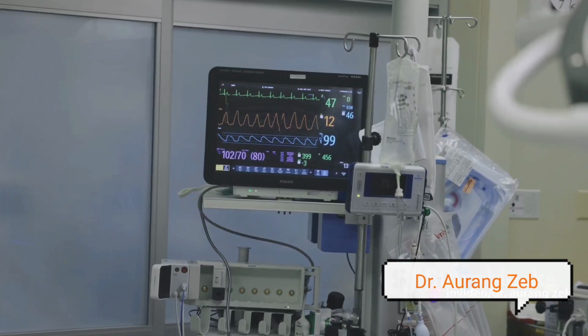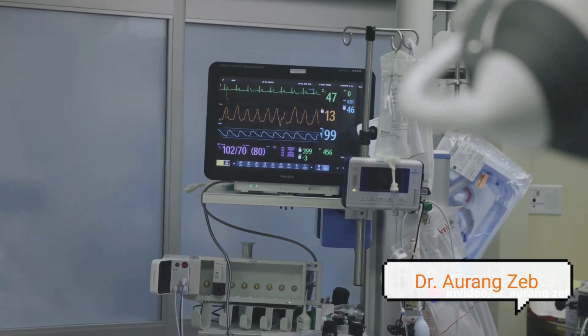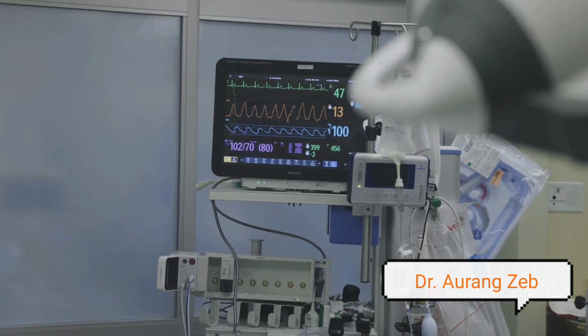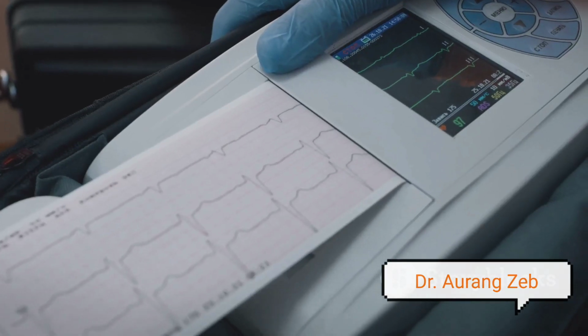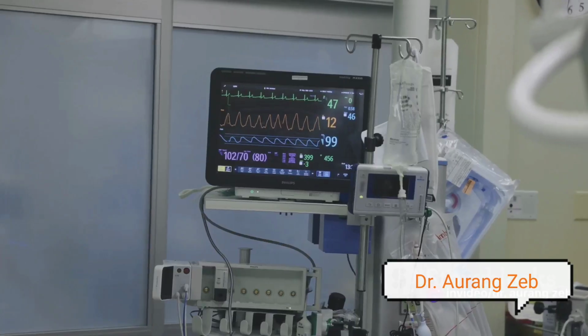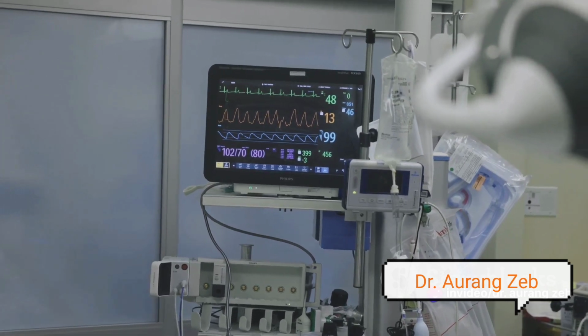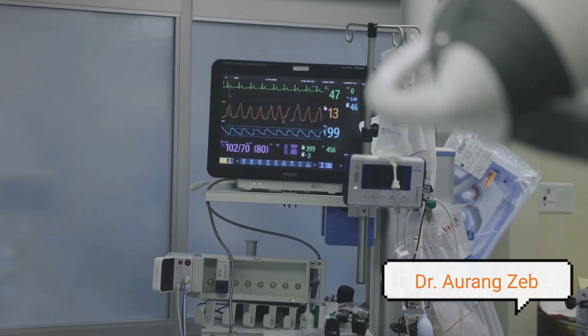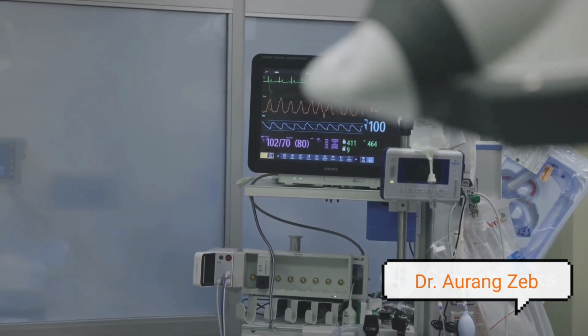If any abnormalities are detected, describe them accurately and note their severity. It's also helpful to mention any associated findings that could provide context to these abnormalities. Finally, you'll draw a conclusion. This should be a synthesis of your findings, where you identify any cardiac conditions present and comment on their severity. It's also the place where you answer the clinical question that prompted the echocardiogram in the first place.